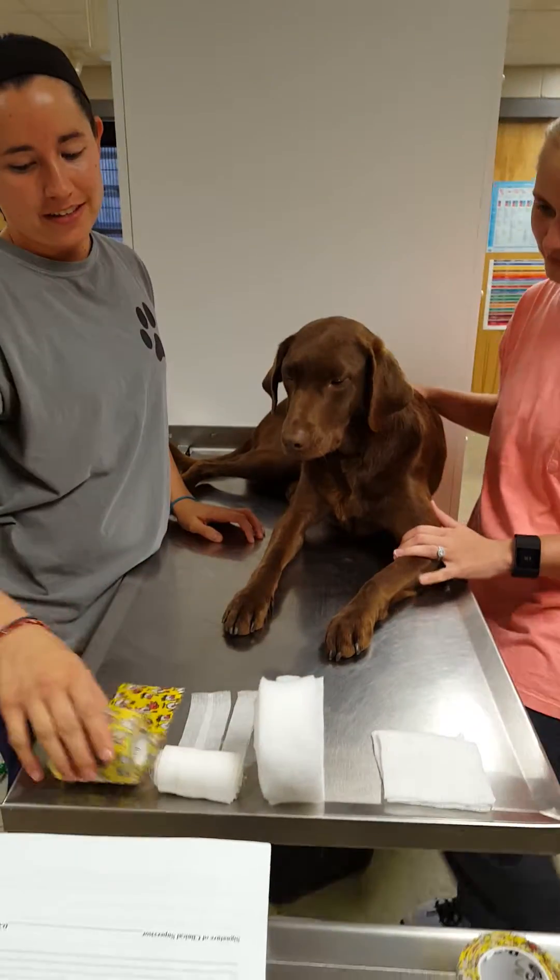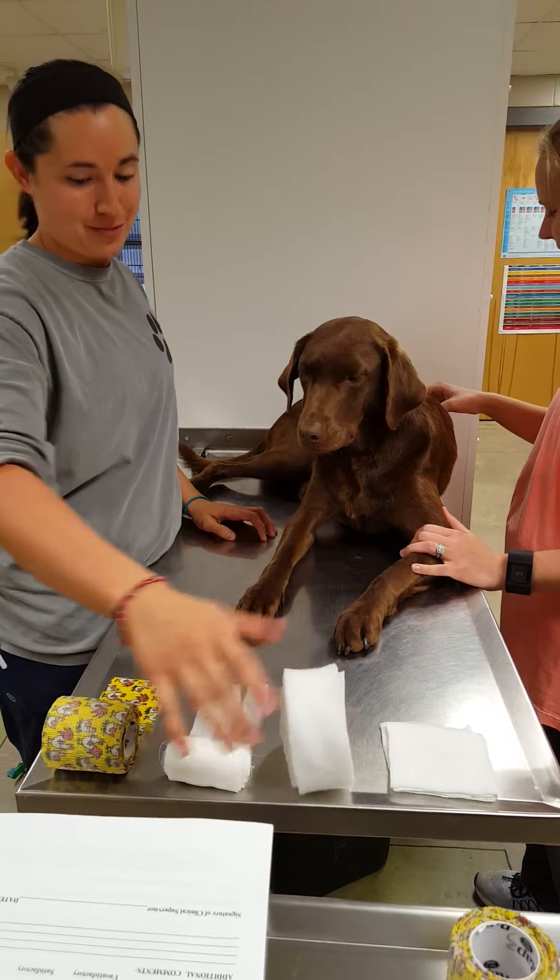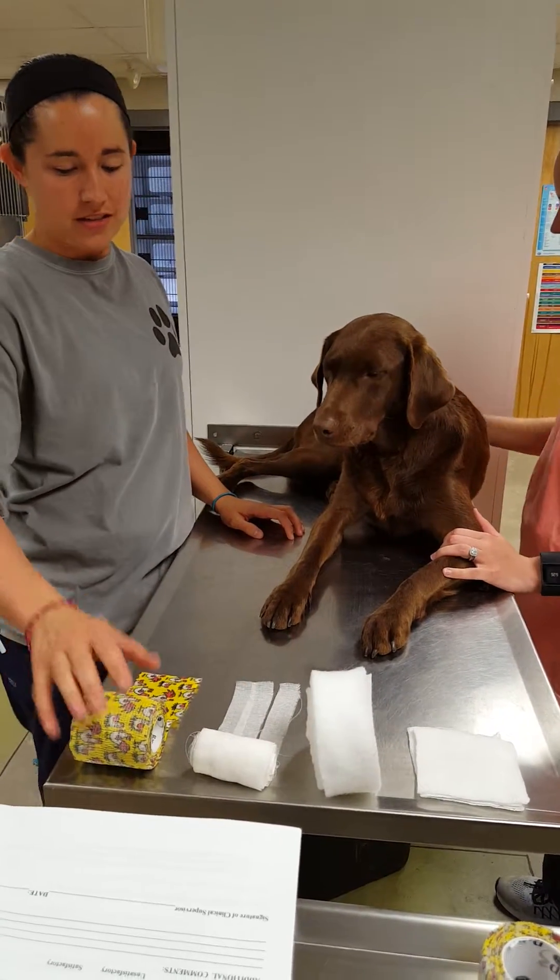I have all my necessary tools here. I have gauze, cast bandage, gauze wrap, and vet wrap.